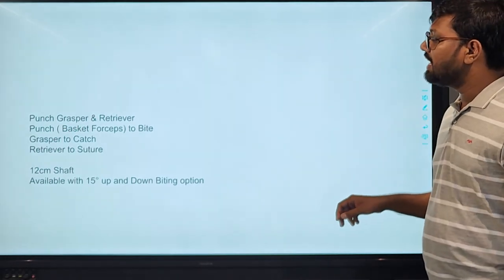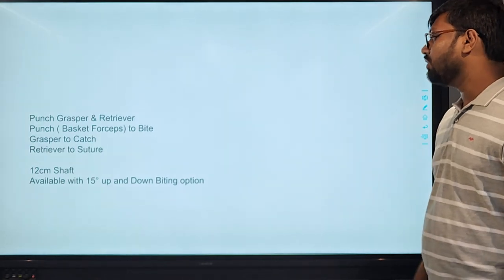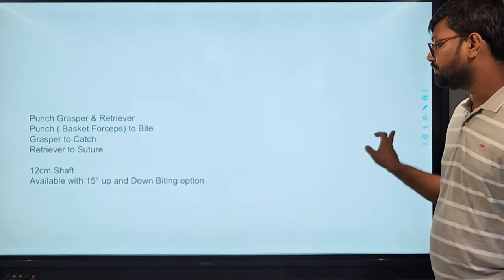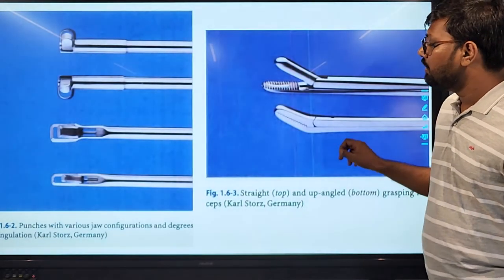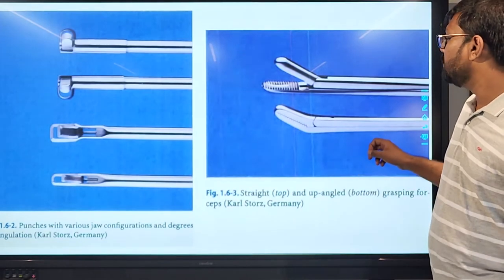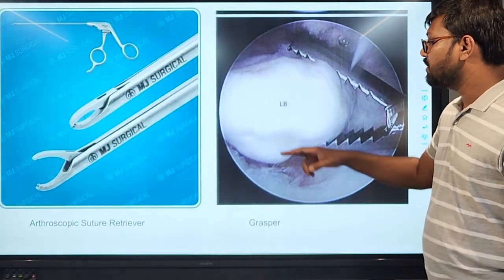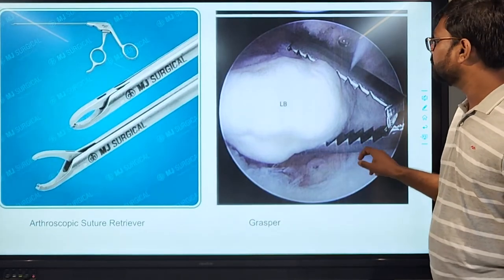Various punches, graspers and retrievers. Punch to bite and cut the degenerated tissue, grasper to catch it, and retriever for the suture retriever. They are available in 15 degree up and down biting positions. These are the punches, various sizes of up and down biting punch. These are the straight and curved angle graspers. This is the arthroscopic suture retriever, and this is the grasper holding that loose body.